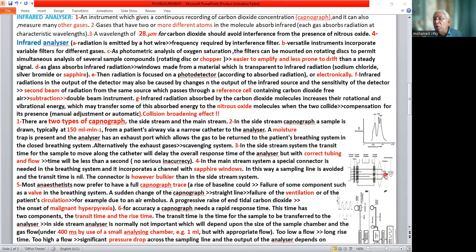Before going to the chamber, one of the parts is going to the chamber, and the other one goes to a chamber where there is a CO2 free gas. So the final concentration will be subtracted from both of these chambers to go to the final reader.